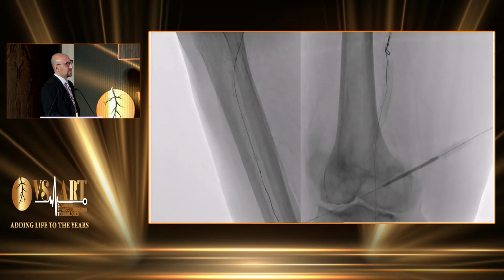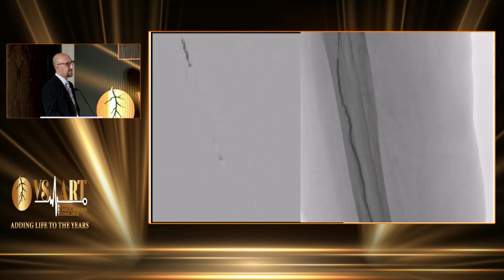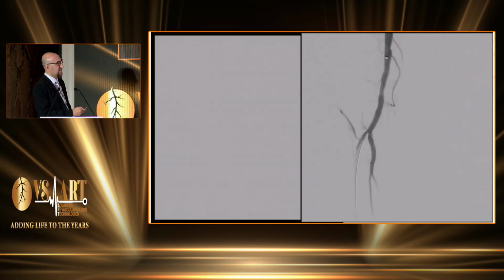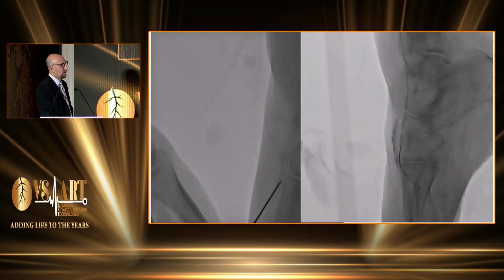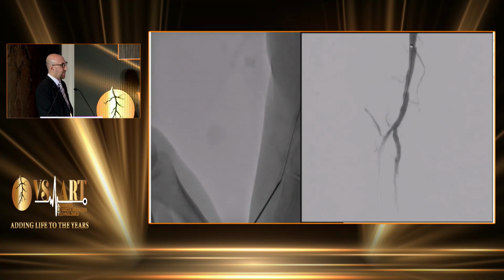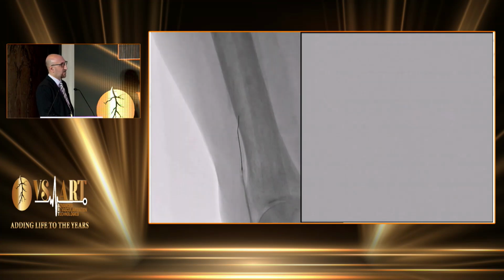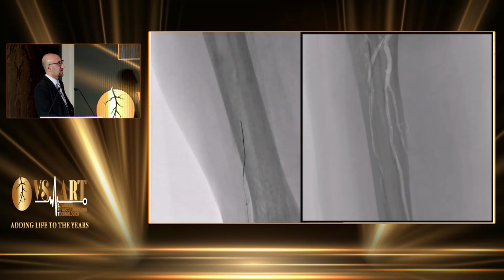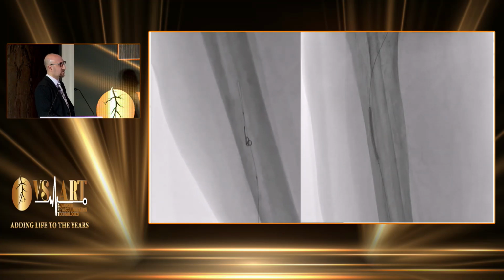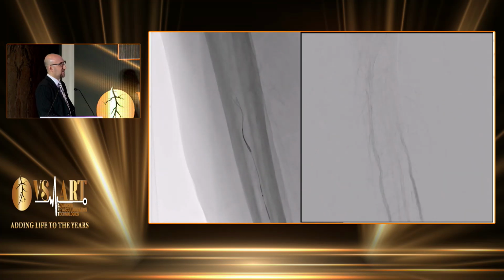And as we can see here, I went from the antegrade vessel, but again, I failed to recanalize the anterior tibial artery from the antegrade vessel. As we can see, some dissections and perforations. I stopped the maneuver. Then I tried to go in a retrograde calcium-guided manner, and it was a heavily calcified vessel, as we can see here, going with an XT Armada supporting from the retrograde access with a 014 wire, trying every time to do some pre-dilatation to proceed a few centimeters. It was very heavily calcific vessel.